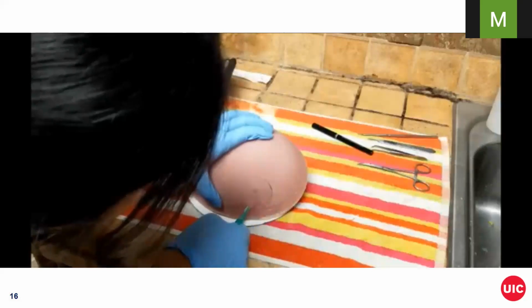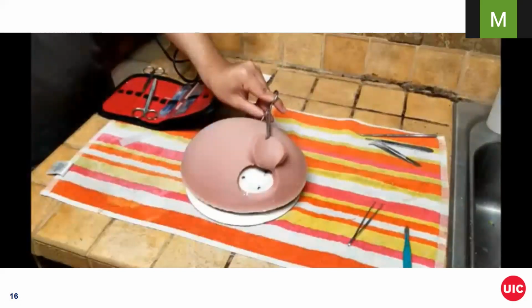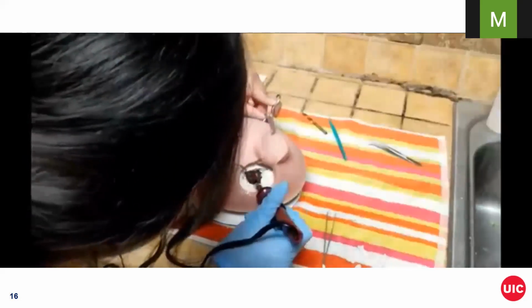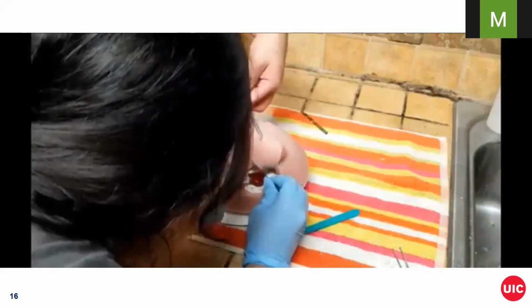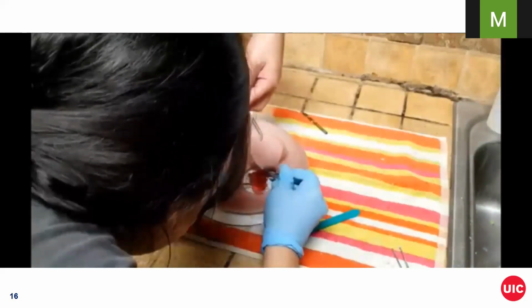The skin flap was then peeled away, exposing the bone where three 3/16 burr holes were made in a triangular fashion, which was then connected by 1/16 drill marks in order to easily remove the simulated bone layer, gaining access to the brain mass. Commonly in craniotomies, an electrosurgical unit is used to cauterize through the brain to gain access to the tumor. In place of that tool, we improvised with a wood burner and slowly separated the tumor adhered to the brain, successfully removing the tumor.